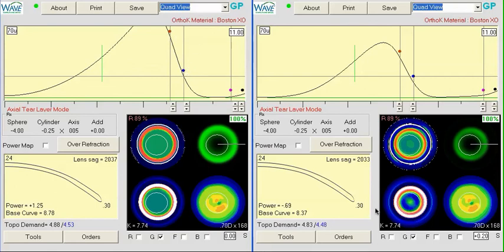In the case submission, there is also a comment about turning off the blending on the lens, and I think that may help a little bit too. I've seen where the sharper transition in the reverse curve of the lens does give a little bit more room. But I have not seen that work if you add asphericity to the lens.